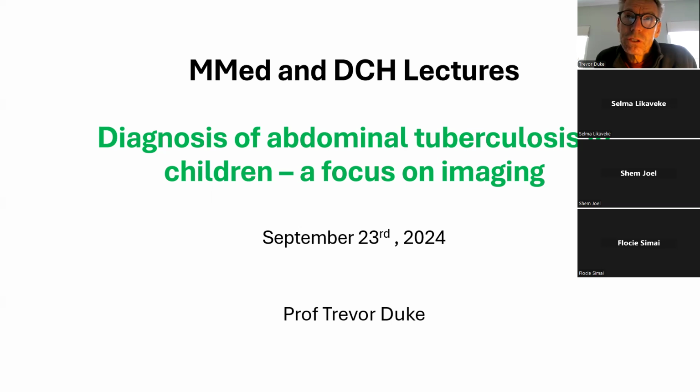It's possible to teach yourself about ultrasound, and it certainly shouldn't replace the clinical process for making diagnoses, but it can add to that. I want to try to describe today how it can add to the diagnosis of abdominal TB. It doesn't replace the way we normally diagnose abdominal TB, but can add to it and can assist the diagnosis in a very good way, I think. So this is what we'll talk about today.